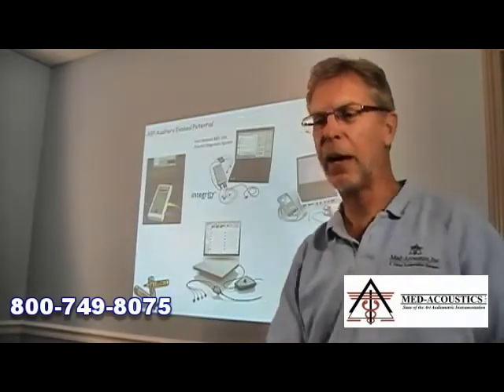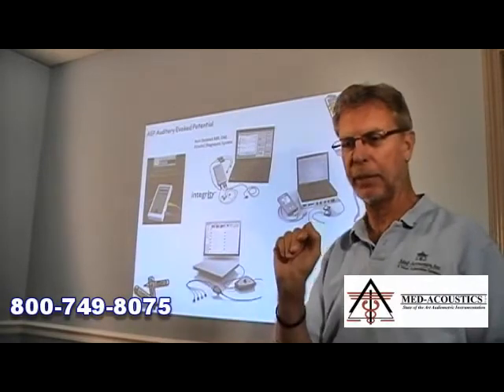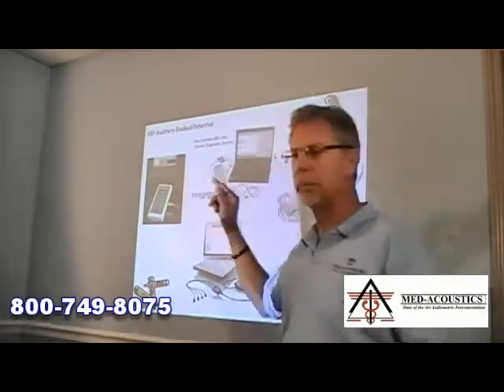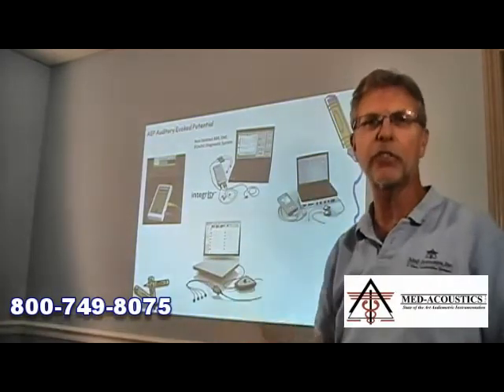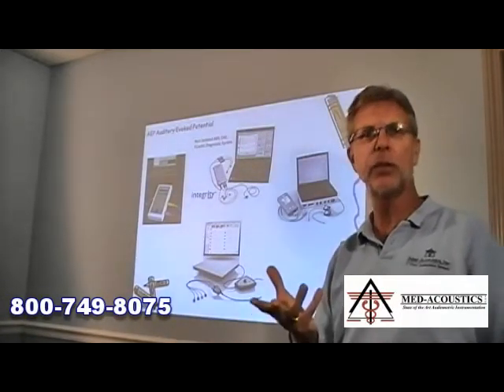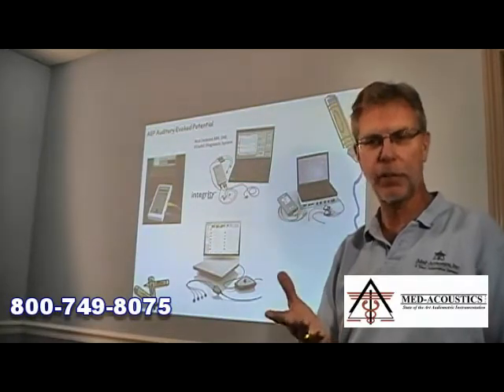All right, let's look now at what's out there. Okay, here to me are the 4 top best-selling brands out there, and they all certainly have their place. Okay, over here is the Biologic Navigator Pro. It is very much a standard of the industry. Okay, and there's probably more of those in use in clinics throughout the United States than any of the others. So that's certainly a viable option.